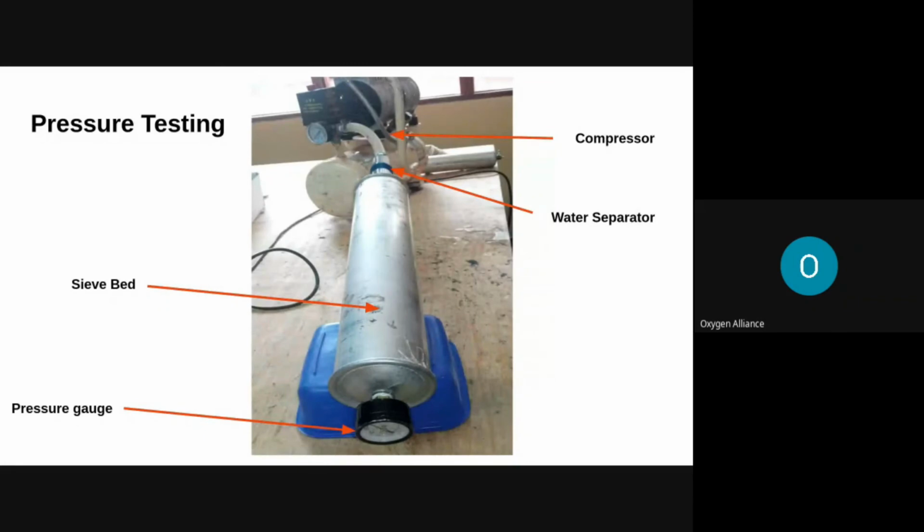Finally, another cause might be loose screws on the end cap. For the end cap that has screws, like for the OxyPure, the J5, the Longfei, if you do not fully close the cap by tightening the screws, that allows the air to escape. So that's basically the process of refilling the sieve beds.